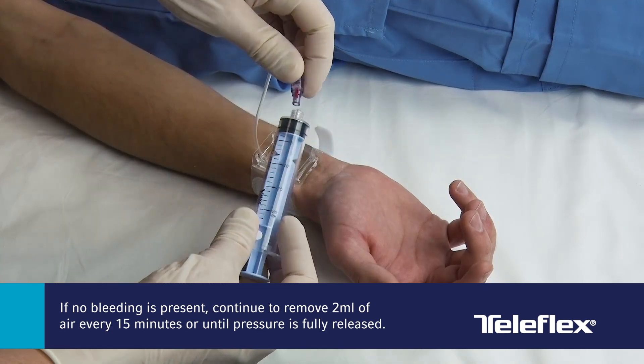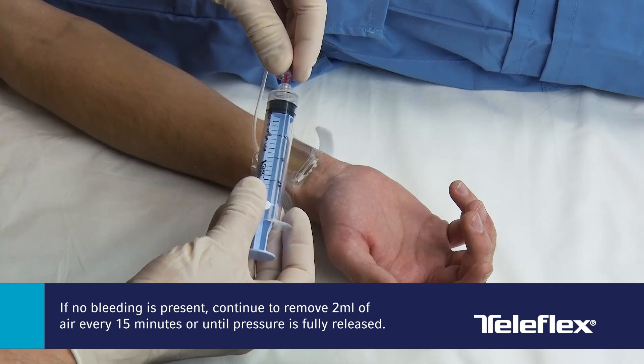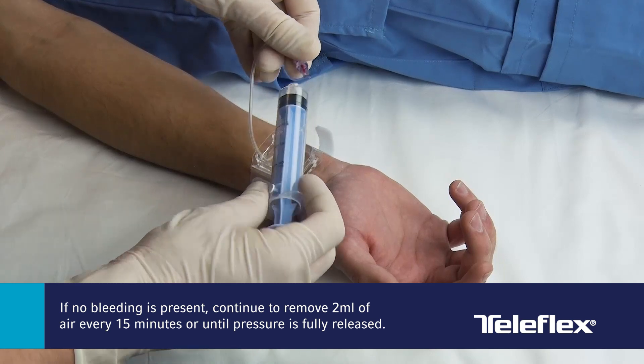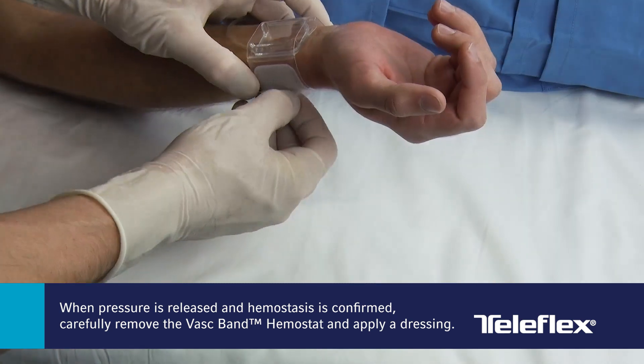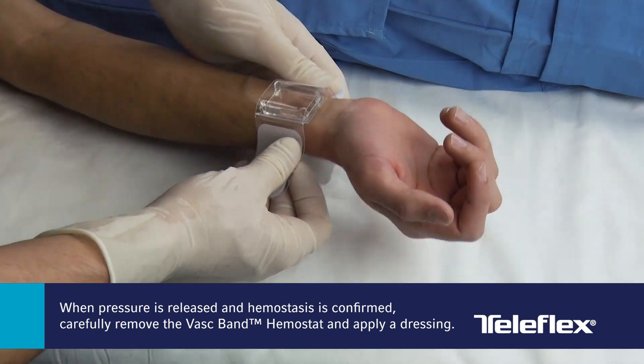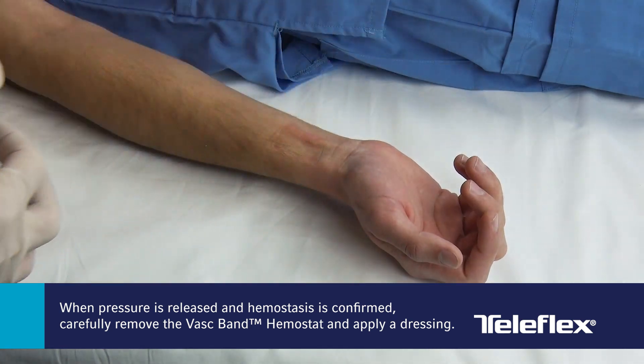If no bleeding is present, continue to remove 2 mL of air every 15 minutes for 3 times or until pressure is fully released. When pressure is fully released and hemostasis is confirmed, carefully remove the VASC-Band hemostat from the puncture site, being careful not to disrupt the clot. Apply dressing of choice.